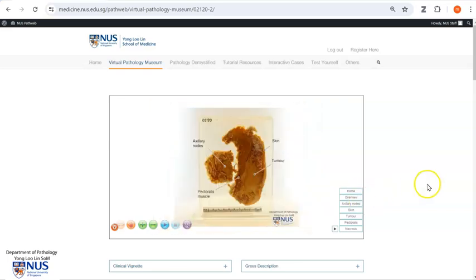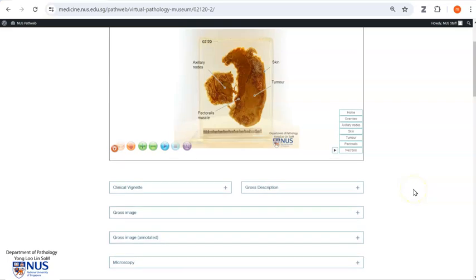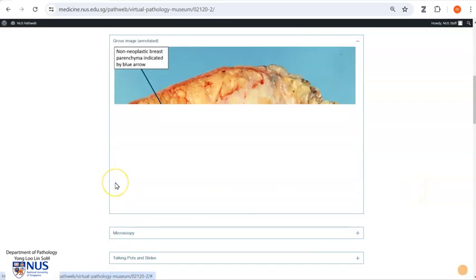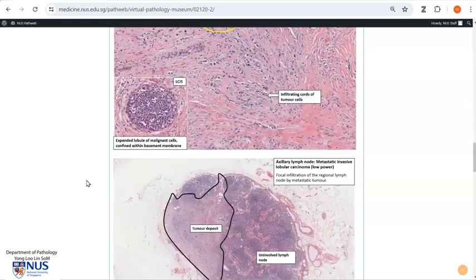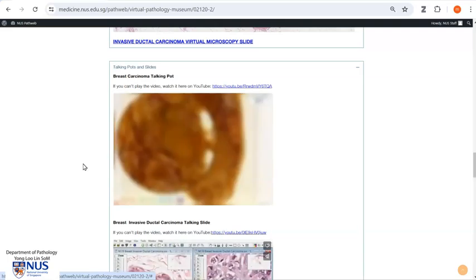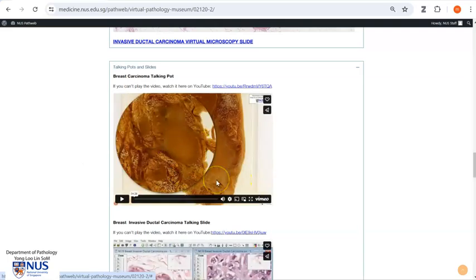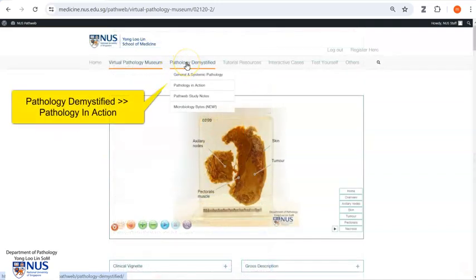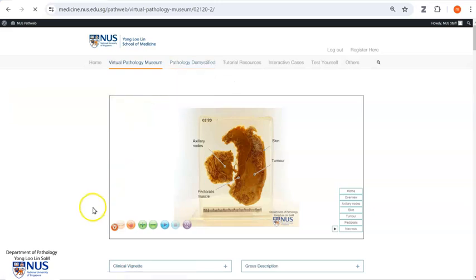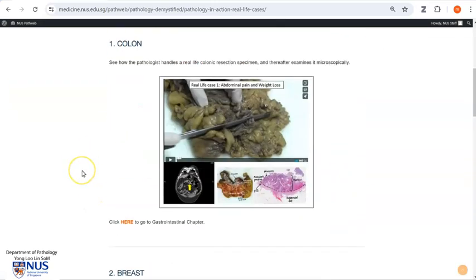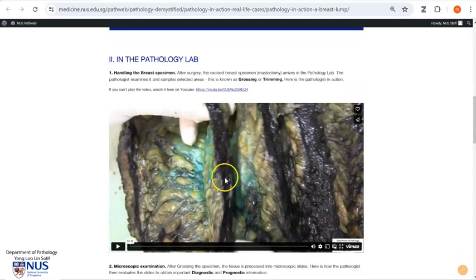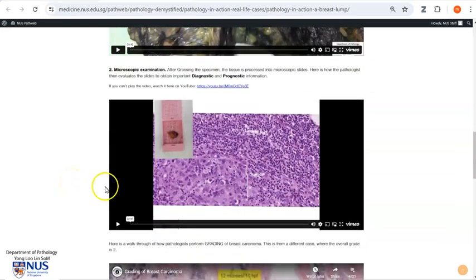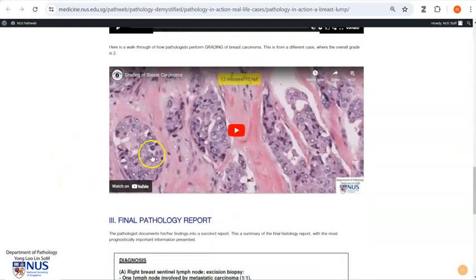You can simply view the annotations or examine the specimen with greater detail. If you scroll down, you will also be able to see gross and microscopic annotated pictures, and also examples of talking pots demonstrating the virtual pathology specimen. If you are interested in seeing how pathologists handle breast tumor cases, you can go to Pathology in Action and explore the breast pathology page, where we can walk you through a case of how we handle the gross specimen of a resected breast carcinoma, examine it microscopically, and pick up important prognostic information such as grading of breast carcinoma.